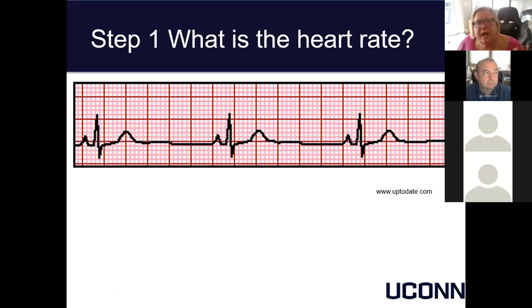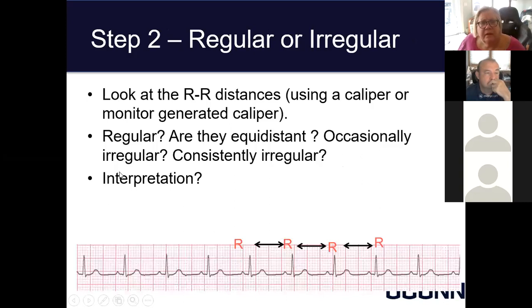Using whichever methodology. And again, you see a P wave before the QRS in each of these 3 complexes. And if it's regular versus irregular, again, you're measuring that peak R wave to make sure it is equal and regular.